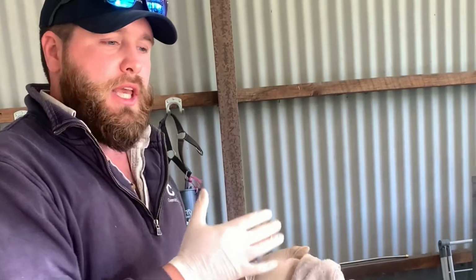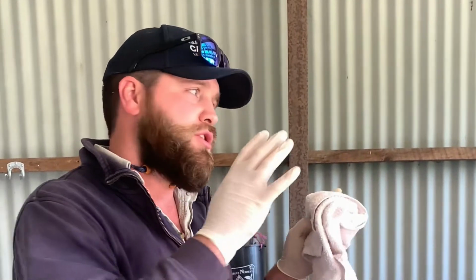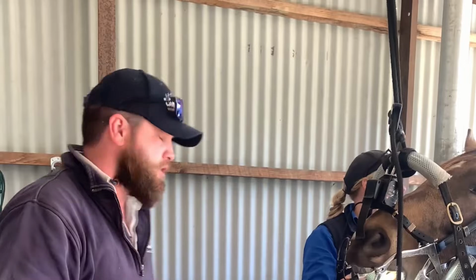The floating isn't the key. Very many people can use rasps and do a very good job with their floating, but it's looking and actually having a good feel and getting those tools right the way to the back so you don't miss sharp points at the back, which you can't achieve in a non-sedated horse. So the modern technology, which has been around for a while now, allows us to do more horses more efficiently and safer on ourselves and safer on the horses. But it does mean that we have to have them sedated. So that's why we use sedation as well.